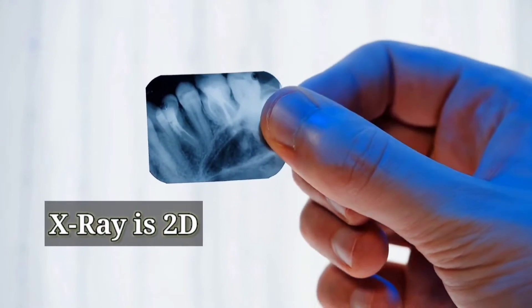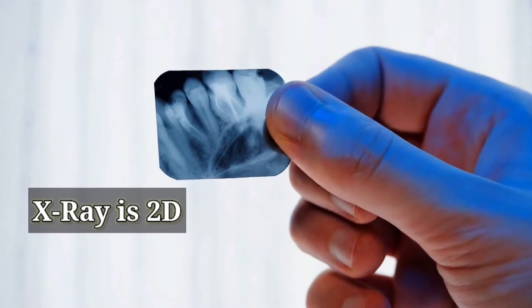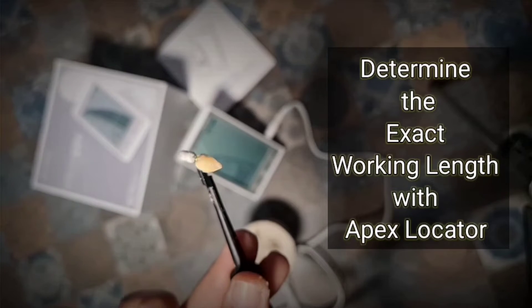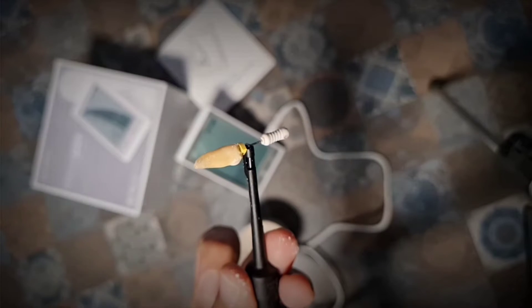A dental X-ray radiograph is a two-dimensional imaging — it is just 2D and does not give the correct picture of the apex. Now you can say goodbye to the guesswork and hello to precise measurements in dentistry. The apex locator determines the exact working length; as the name suggests, it locates the apex of a root.